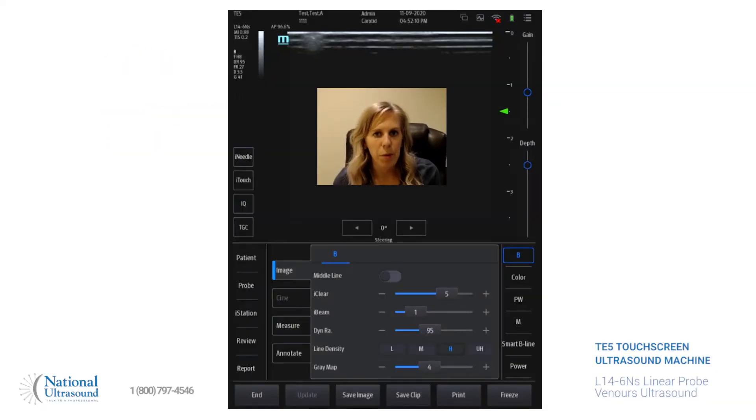Hi, I'm Chelsea Zabriskie. I'm a registered sonographer in general, vascular, and cardiac, and I've been doing ultrasound for seven years. Today I'm at National Ultrasound and we're looking at the Mindray TE5 with a linear probe L14-6NS. We'll be doing a venous ultrasound today looking at dual screen and some of the other features.